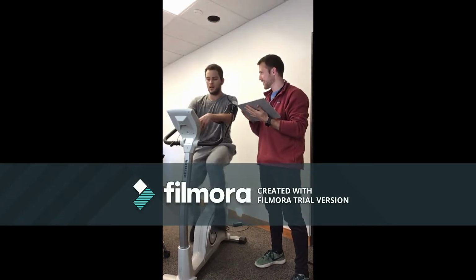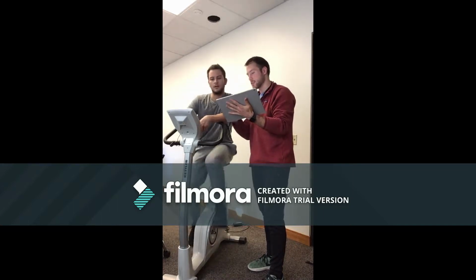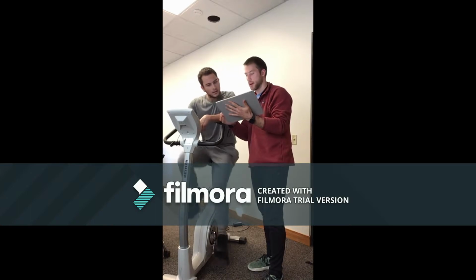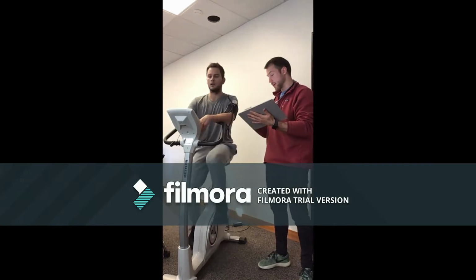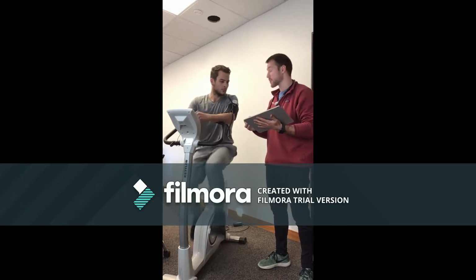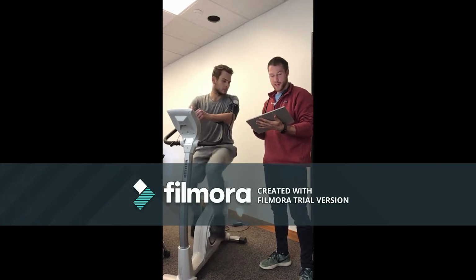Feel okay? Yeah, a little sweaty, but you know. So, would you say on that RPE scale again, that 6 to 20, where would you say you're at right now? I'd say about 13. Okay, great. So correlated really nicely again with that heart rate. You're at 134. Your blood pressure, which I just took, was 136 over 82. So everything's kind of responding really well to the exercise.